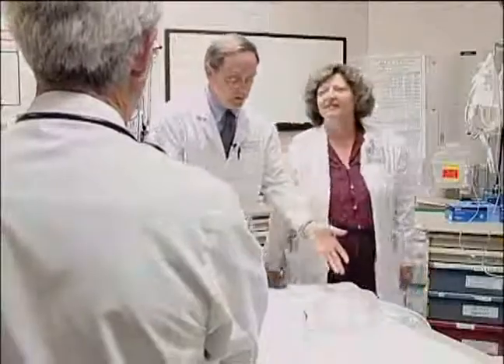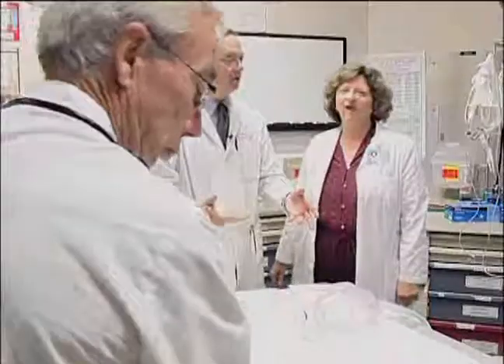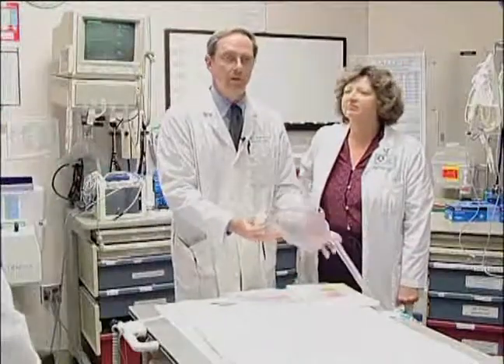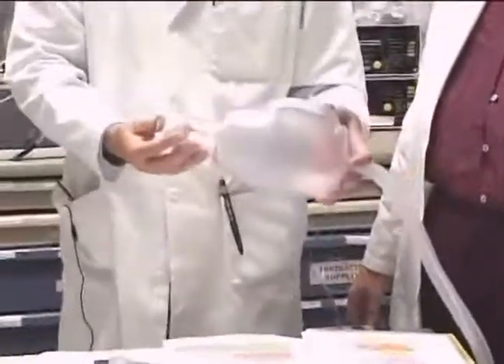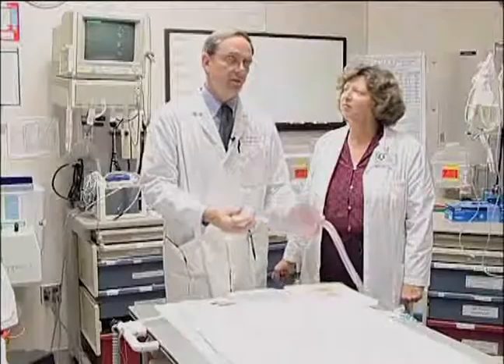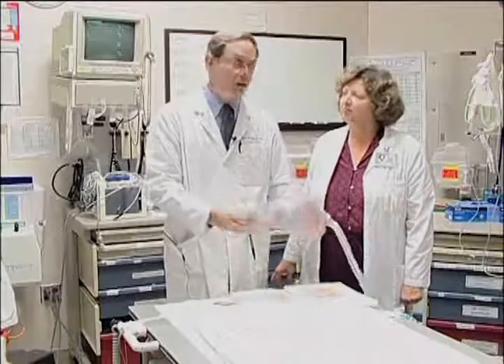Patient's now on the table. We get a quick auscultation of the patient's lungs. We're going ahead and ventilating them with the ambu bag. Now's the time to ask, is it time to move them onto the ventilator, or are we having difficulty with the patient? We want to maintain hand bagging on this patient. Perhaps there's someone who's difficult to bag, has poor airway compliance, and we want to go ahead and stay with this because this is giving us a tactile feel for what it's like to ventilate their lungs.